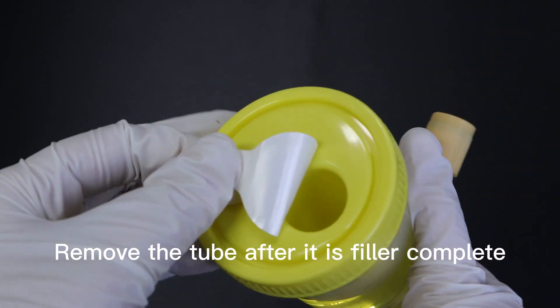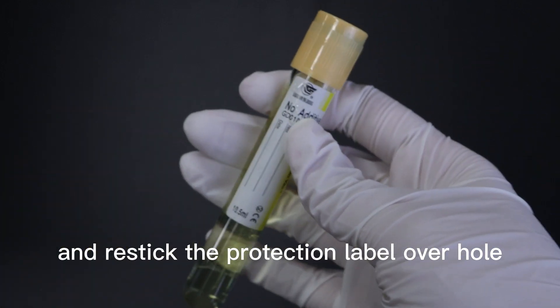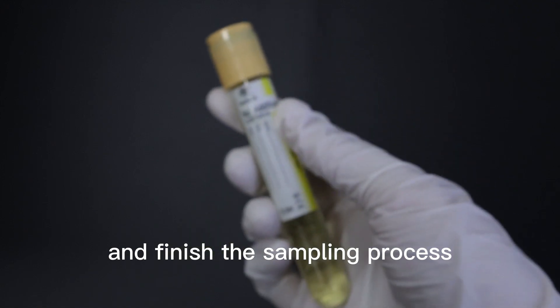Remove the tube after it is completely filled and reseal the protection label. Gently shake the urine tube to finish the sampling process.